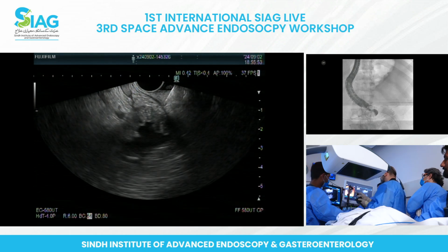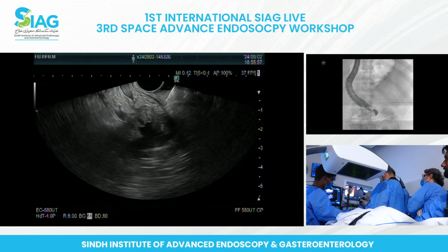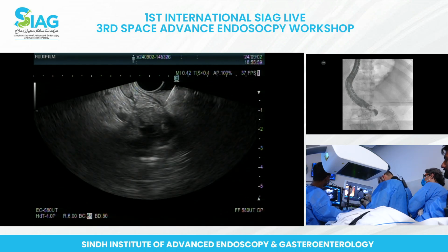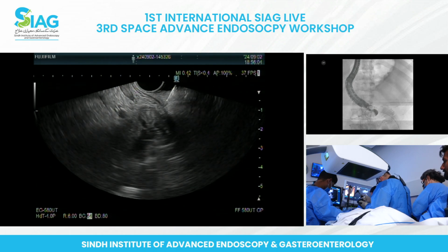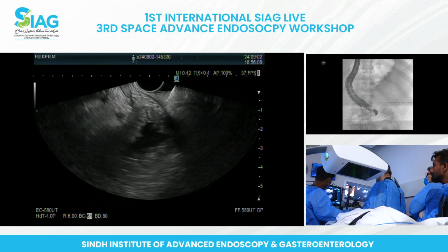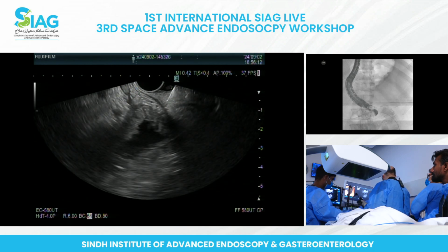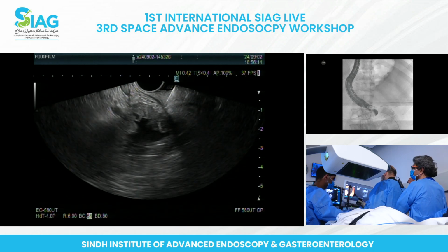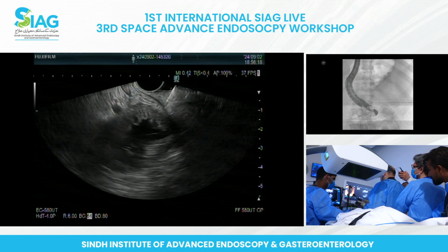So now we're gonna tent and just keep an eye on that bowel, make sure we're comfortable. And then once I have a good window, I'm gonna go for it and go through the steps. I won't be talking then, but yeah, you can talk. Yeah, we are watching, so you continue doing what you do. You've already explained what you want to do.